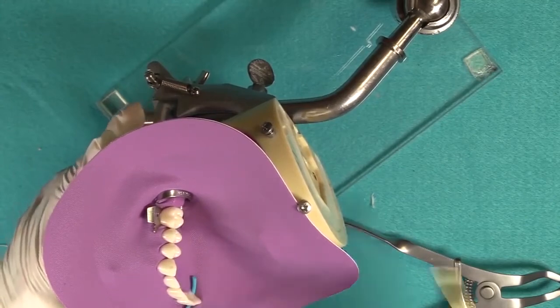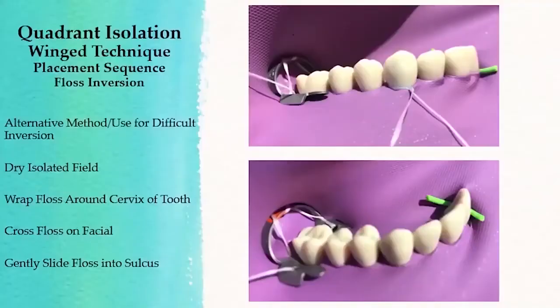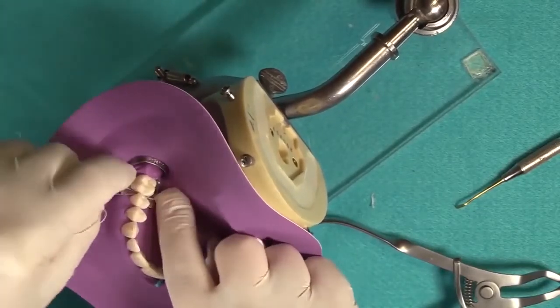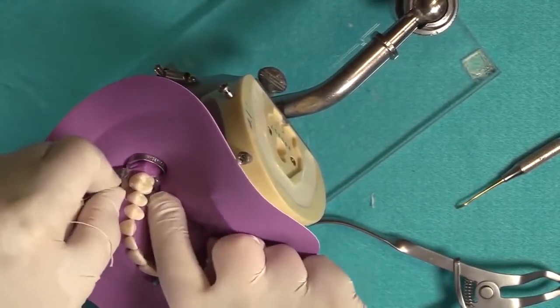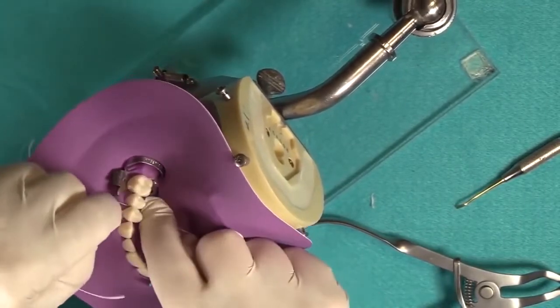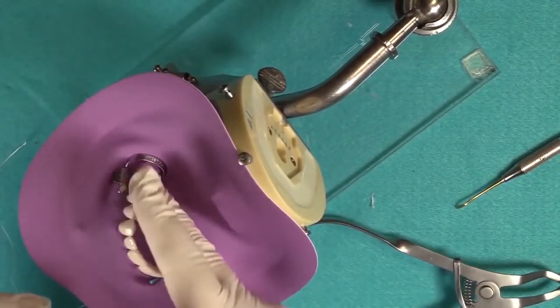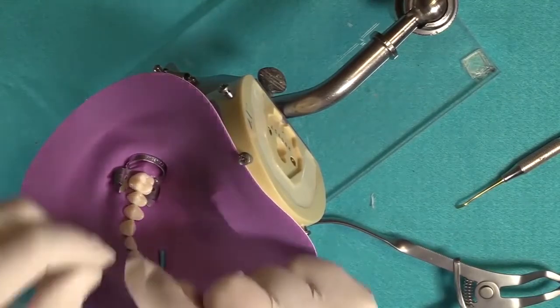Now, if you're working by yourself, I'm going to show you a trick that I do. I use a flossing mechanism. Usually back here, I can take my floss, I'll loop it, and I basically will floss the proximal areas, the interproximal areas, using my floss. And just by tucking it down, many times in the molar region, the posterior, it'll roll right under. Now, canines, they're always difficult to invert.